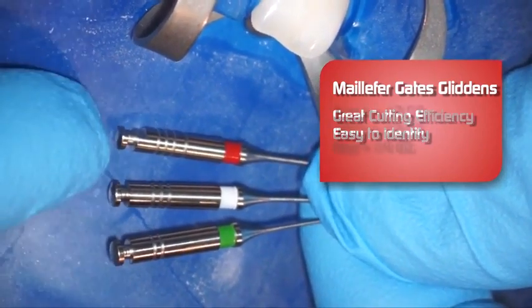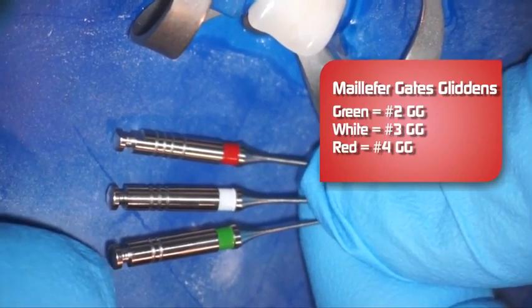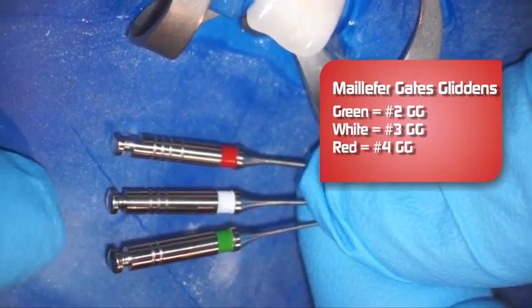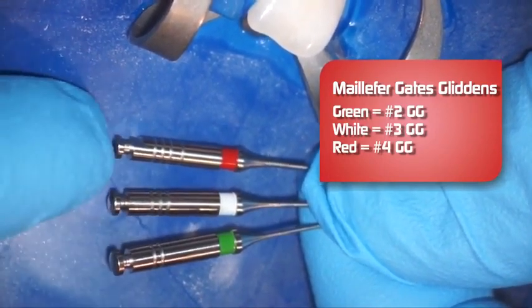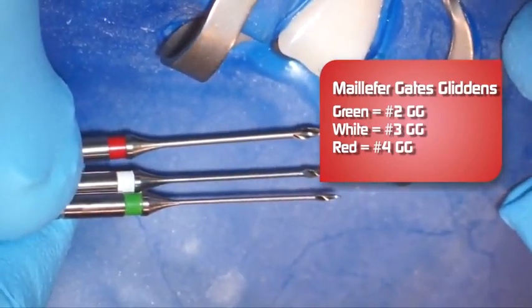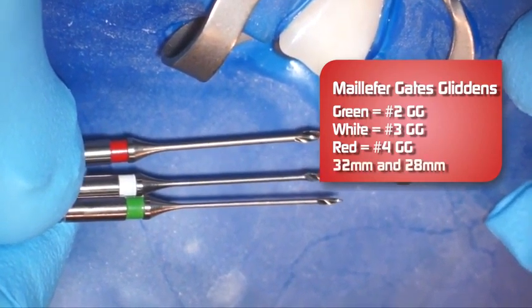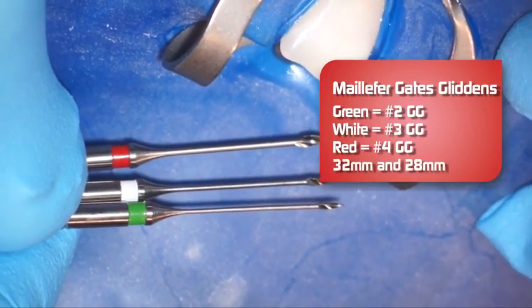We have our markings up here at 2, 3, and 4, and that lets us know the size. So even though it's in your slow-speed latch attachment, you can still see the color and know what size Gates Glidden you have.